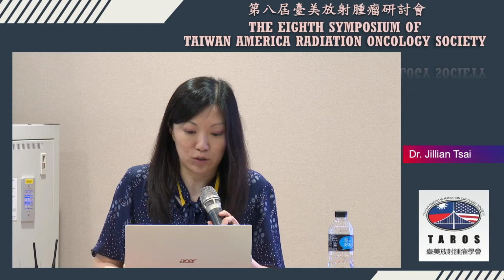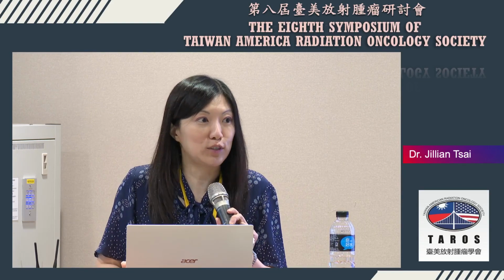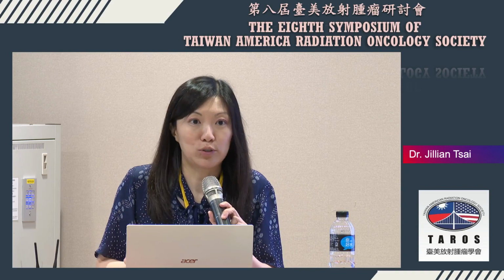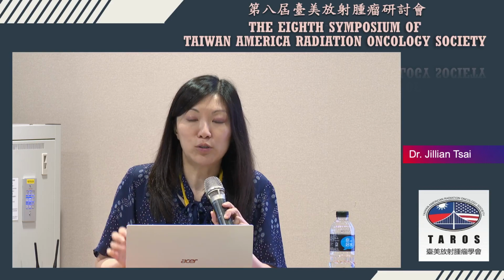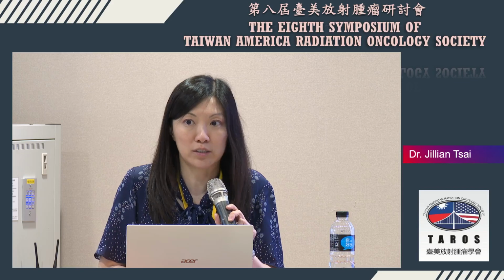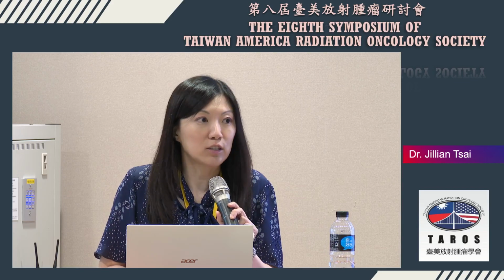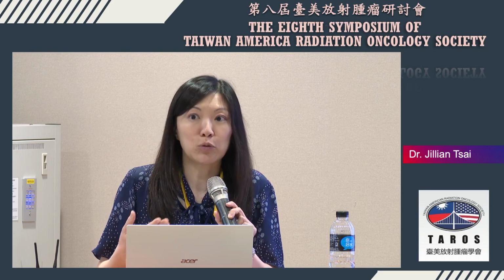I'm going to present several cases, and for each case, there are different approaches that I will present because they come from different institutions. I was trained at MD Anderson, and then I practiced at Memorial Sloan Kettering for 8 years. Now I'm at Princess Margaret. So there are certainly a lot of different approaches for a given case. This is what I'm going to go through.